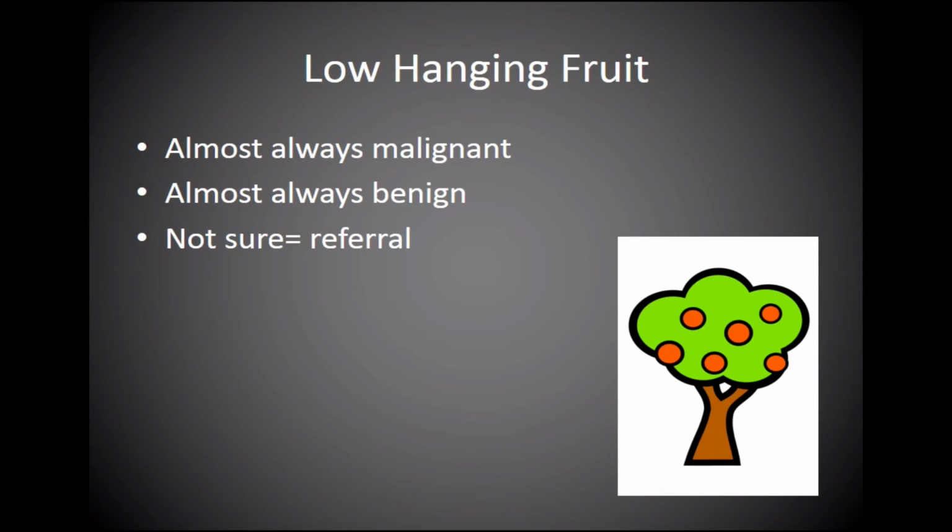If the incidentally discovered nodule is small, meaning less than 1 centimeter, and is cystic or has primarily cystic components containing debris, then it can probably safely be ignored. If the nodule is solid, then a follow-up ultrasound exam or follow-up clinical palpation of the neck can be performed. If the nodule grows between the 2 evaluations to the extent that it is palpable clinically, then probably a biopsy should be performed guided by ultrasound.